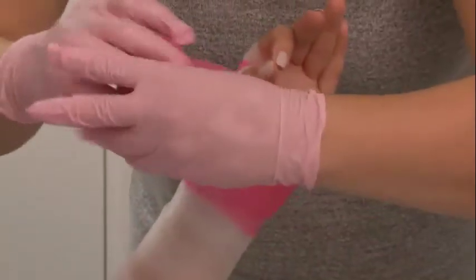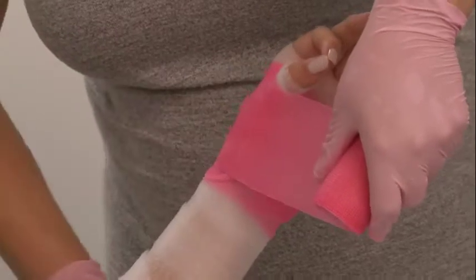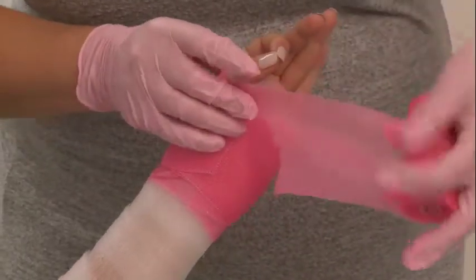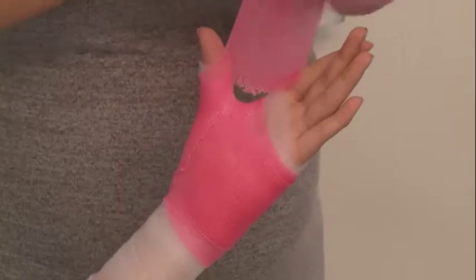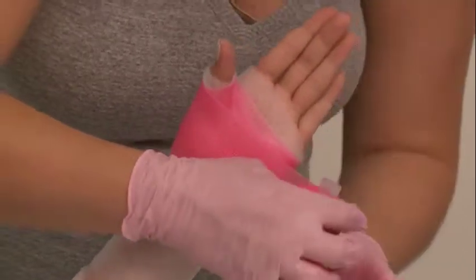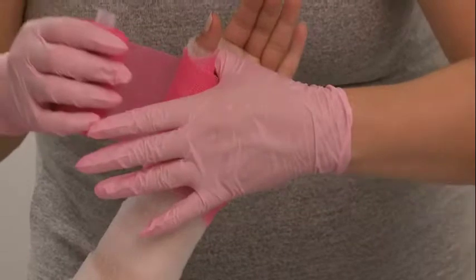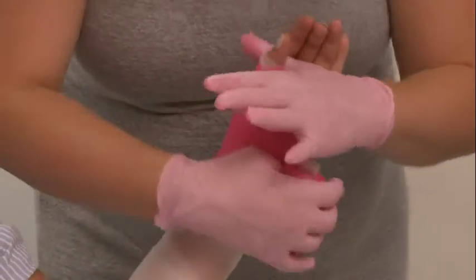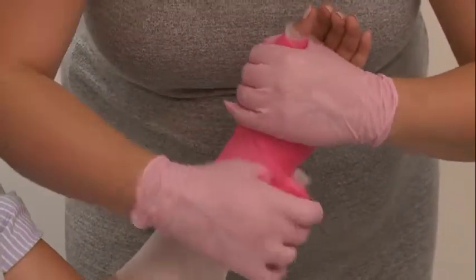You'll just grab those edges together at the base of the thumb, being careful you're not going too high so you leave your MCPs free to flex. We'll come around and grab those loose jagged edges. I'm going to add another thumb layer — again making your cut along the same plane as the first ray and leaving about two centimeters so you've left enough room to cover the IP. Making sure not to touch the material on the patient's fingers, and making sure you've left enough clearance for the IP to flex on the thumb. As I go I'm just adding a bit of contouring through the thenar and web space. It looks a little like it's going to gap, which it will because I haven't wet the material yet — to start with it does leave it a bit more flexible. I'm going to come back at the very end with a wrist layer and that'll stop that gapping at the top, so don't worry too much about that gapping as you go.